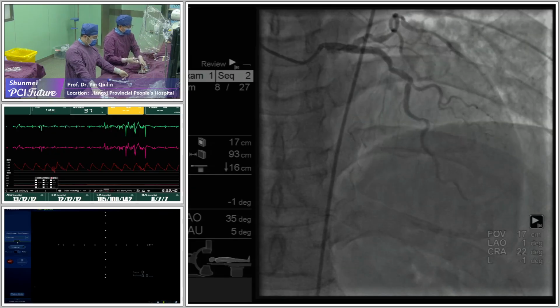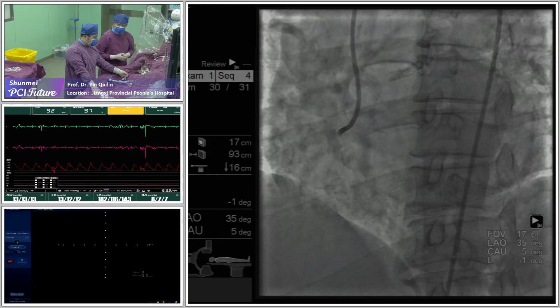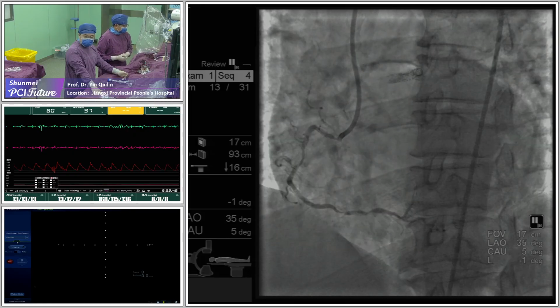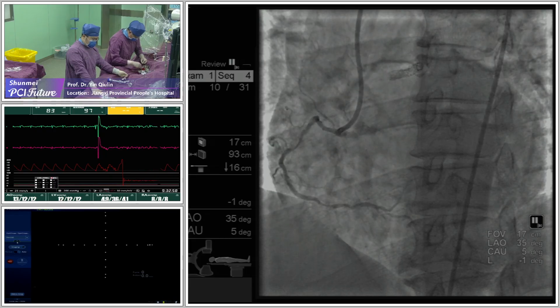As you can see, Ahmet, there is a problem with going through the vessel architecture with the wire. It seems like it is in the architecture, but it is going somewhere different, and we didn't realize any kind of side branches over there.